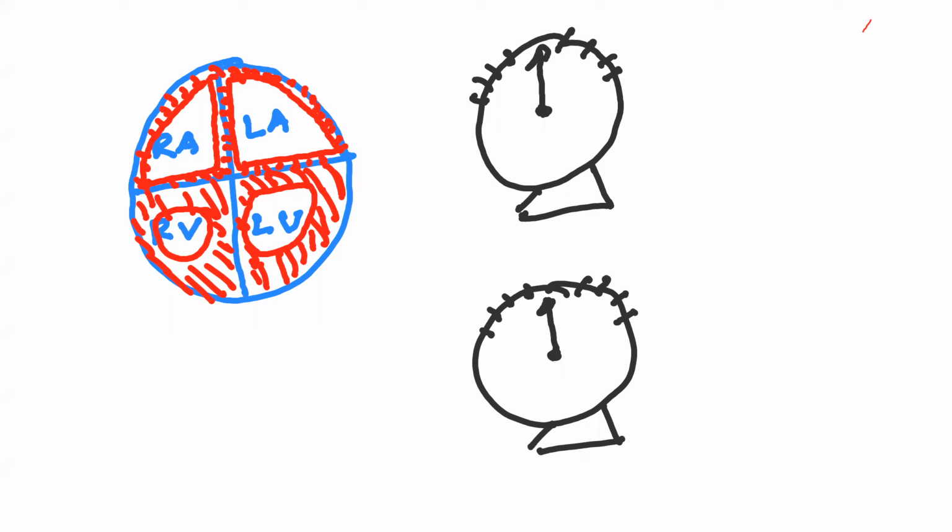Needle fluctuation A relates to the atrial activity, B to measuring the ventricular activity. If I take the needle fluctuation at A as 10, could be negative or positive, what will happen in the ventricle? It should be higher than 10. We think it should be 20.